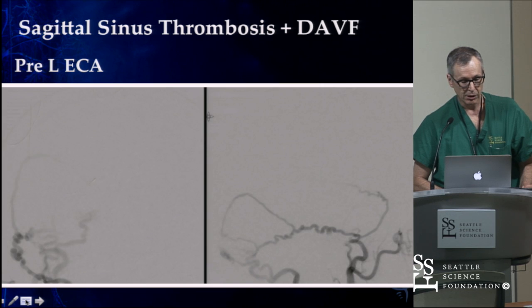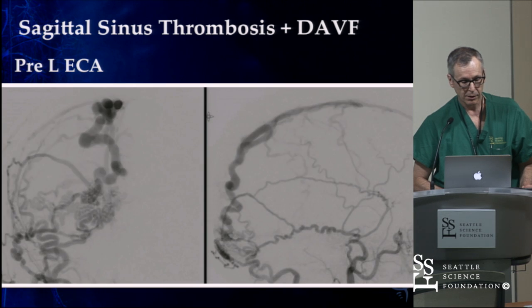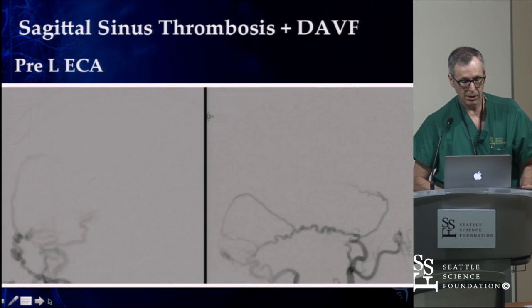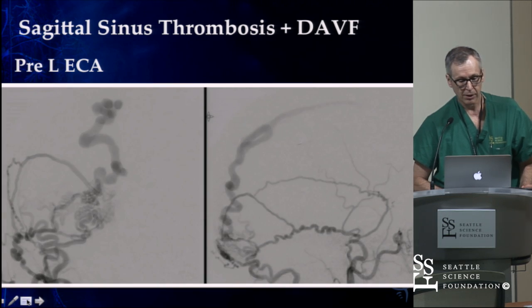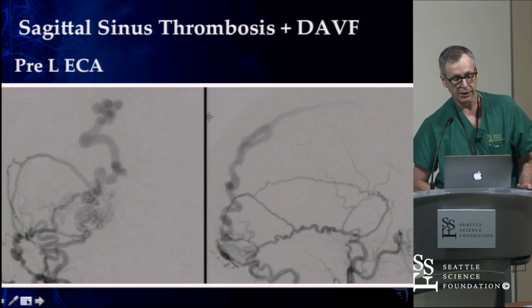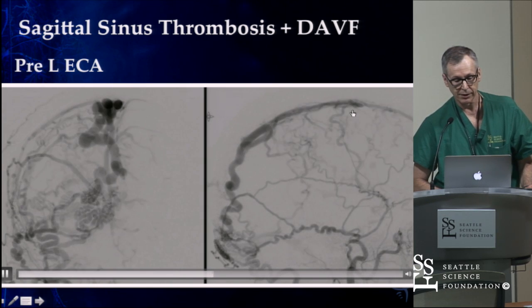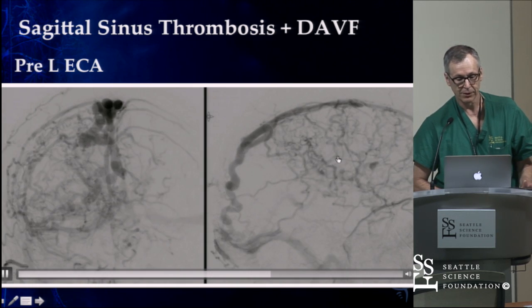And if I can get it to go just a little bit further forward in the frontal view, sorry, I'm having trouble controlling the slider here. There. So now you can see the very first vein is right there. This is the middle meningeal in the frontal view coming around right to the fistula, and everything leads to this point right here. So the fistula's here, this large cortical vein that then extends all the way up here, and everything goes to all these cortical veins as we go on. And the sinus itself is out.